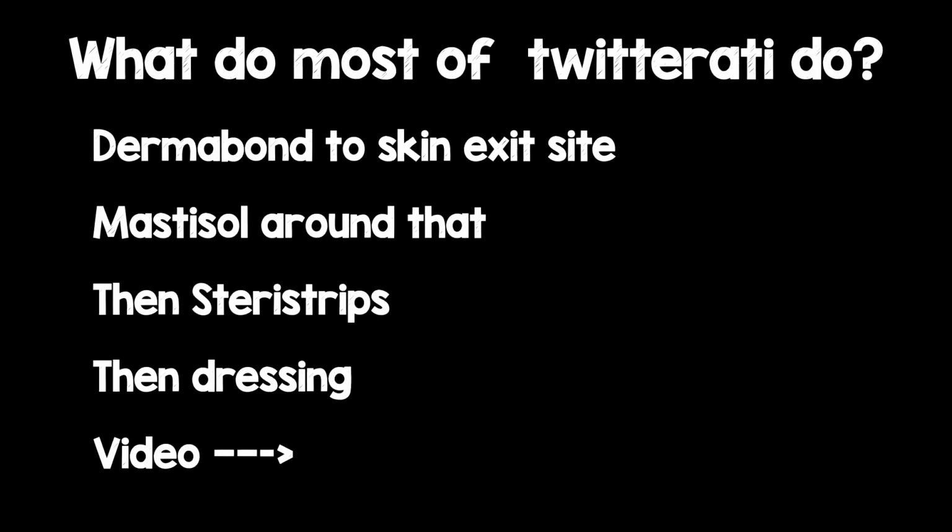So what do most people of Twitter do? Most people seem to use Dermabond to the skin exit site and then put Mastisol around that and then use Steristrips and then a dressing. And I got one of my colleagues, John Edwards, and Stace Dollar to show me a video of what they do.